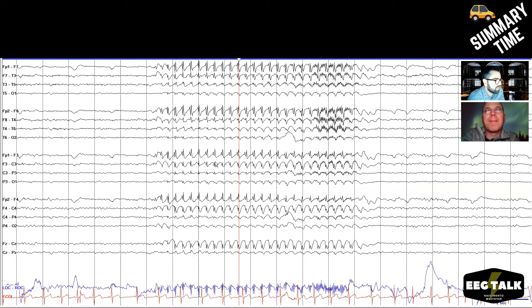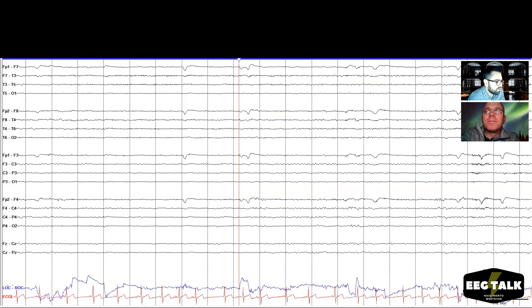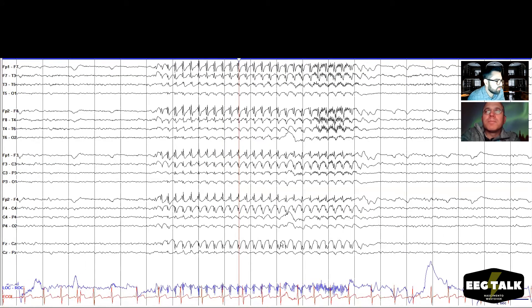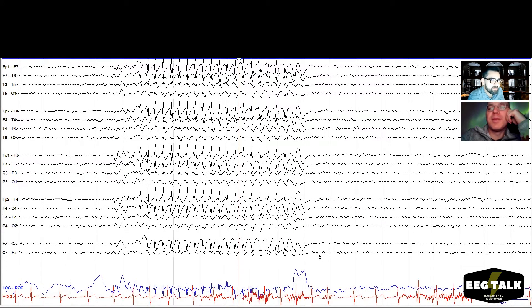Let's make a quick summary. We have spike-and-wave discharges at three hertz — three per second. Amplitude is around 300-350 microvolts. They last nine seconds and may be associated with clinical manifestations. What if these went on and on for a long time? We'd call that absence status — absence status epilepticus.